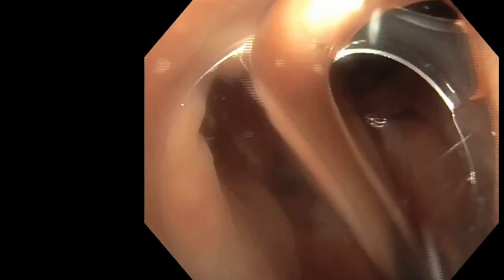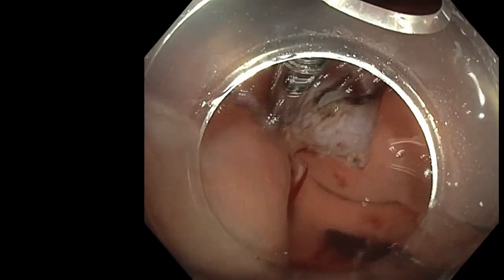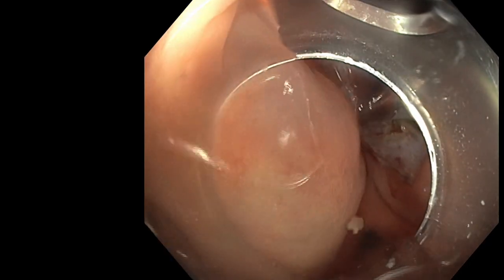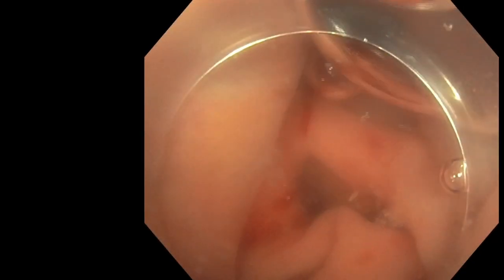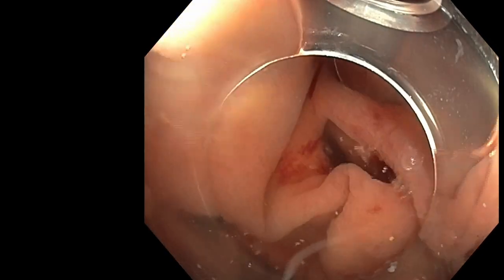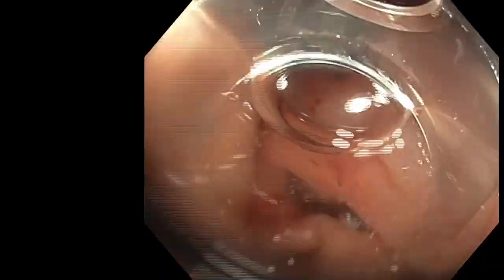I don't perform a lot of incisions in this case, because once one clip is fixed, it seems relatively easy to close the 2 edges thanks to this first clip that closes the area and makes it relatively safe for the diverticular part. Second clip is coming.